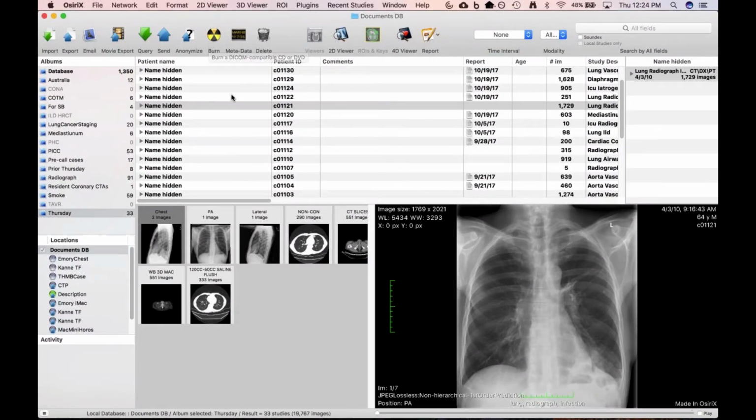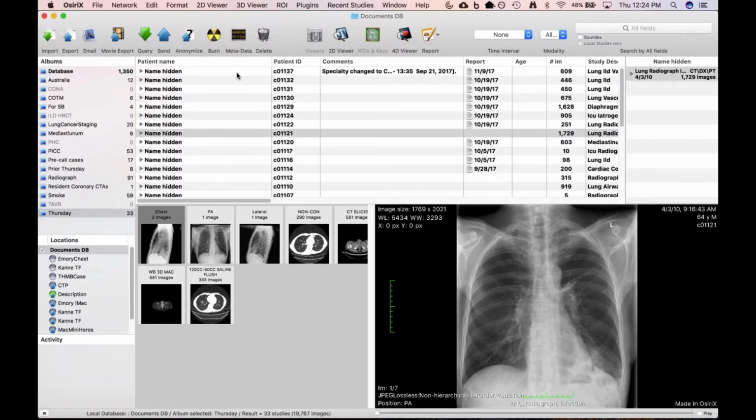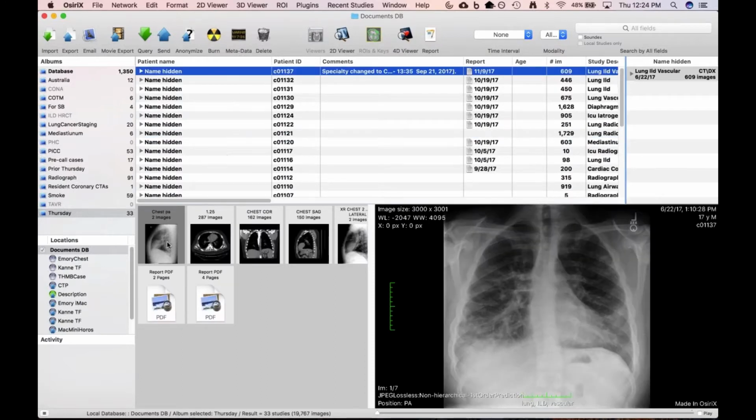Let me show one more for now. This is one I just saw that came into our ILD clinic last week.